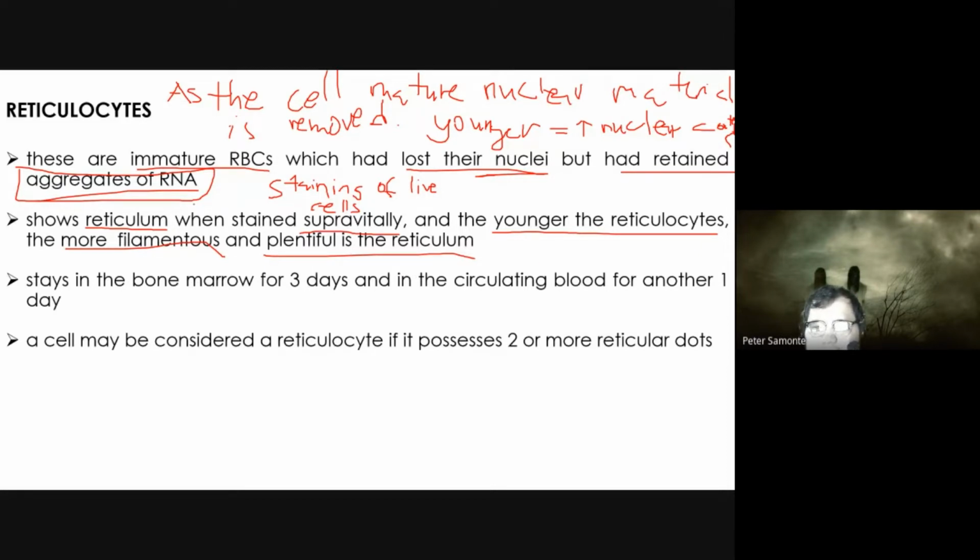When I say reticulum, these are your aggregates of RNA. What does the word aggregate mean, class? Okay, mag-clumps, kumpul-kumpul sa Tagalog. So they would be clumping of RNA.